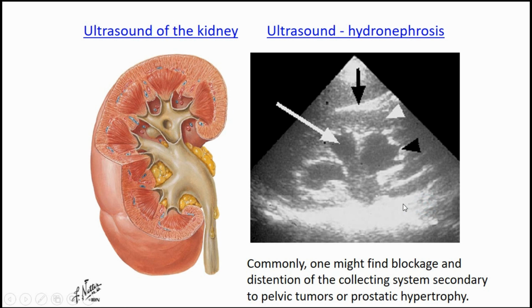Now, these are videos that I think it's a really good idea to get a good look at. They're really well done, and they're showing the different grades, especially this one on the right, how you can use ultrasound to quickly grade the different types of hydronephrosis. Now, I don't want you to memorize what makes one grade another. Just know that you've got varying grades depending on how distended the urinary drainage apparatus is by the inability of the urine to get past a blockage somewhere further down the way.